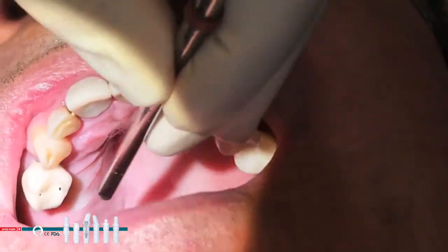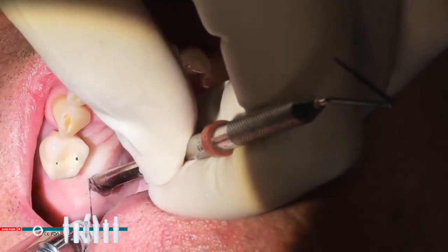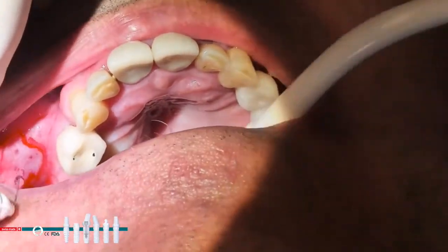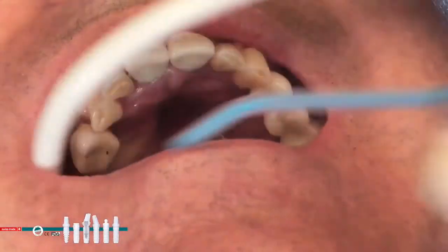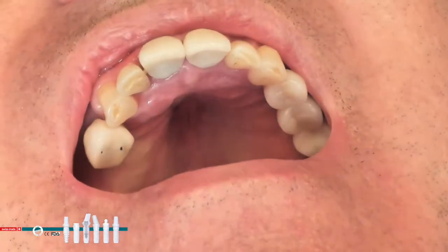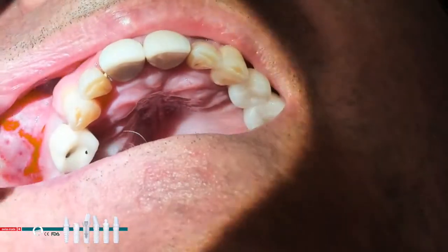Turn your head towards me, please. Open wide. And this is a unique system because they use a ceramic drill, correct? Right. They have all ceramic drills, which helps because they don't go dull. With the titanium drills, you have to replace them after 15, 20 times of using. And these I can use up to 80, 90 surgeries and still be okay. Wow. That's the nice thing about ceramic.